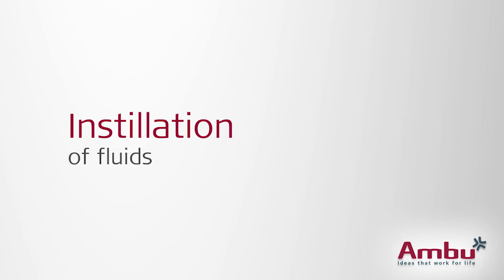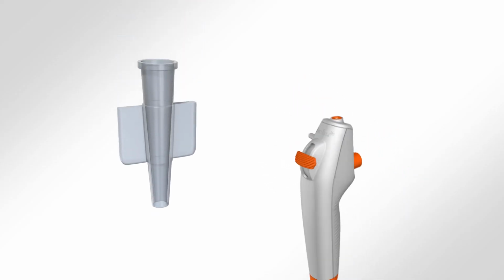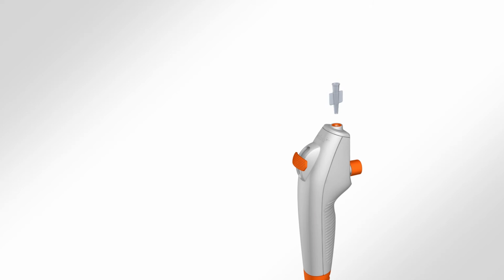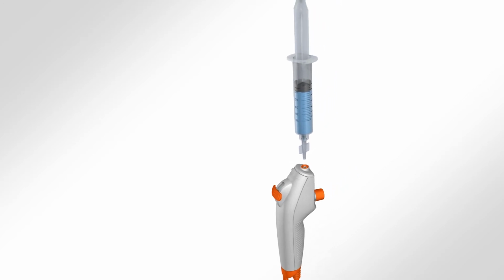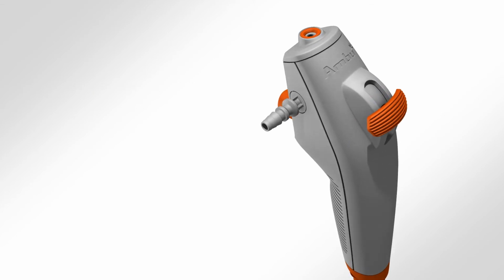Fluids can be instilled through the working channel by inserting a syringe into the working channel port at the top of the aScope. When using a luer lock syringe, use the included introducer. Insert the syringe completely into the working channel port or introducer and use the syringe to instill fluid. To expel the fluid left in the channel, flush with 3 to 4 milliliters of air.